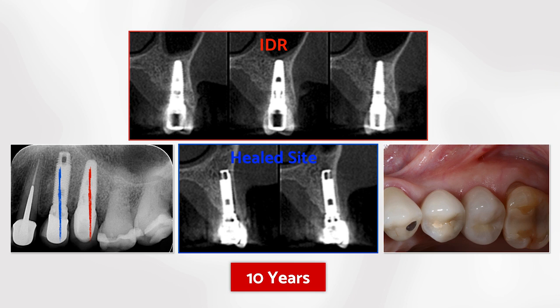And take a look at the difference in thickness of the buccal wall of implants inserted in a healed site and a post-extraction socket. This is what I usually say, that a post-extraction socket would never become an edentulous site for late implantation. It's because it would increase the number of procedures, the cost and the treatment time, and of course the unpredictability of results.